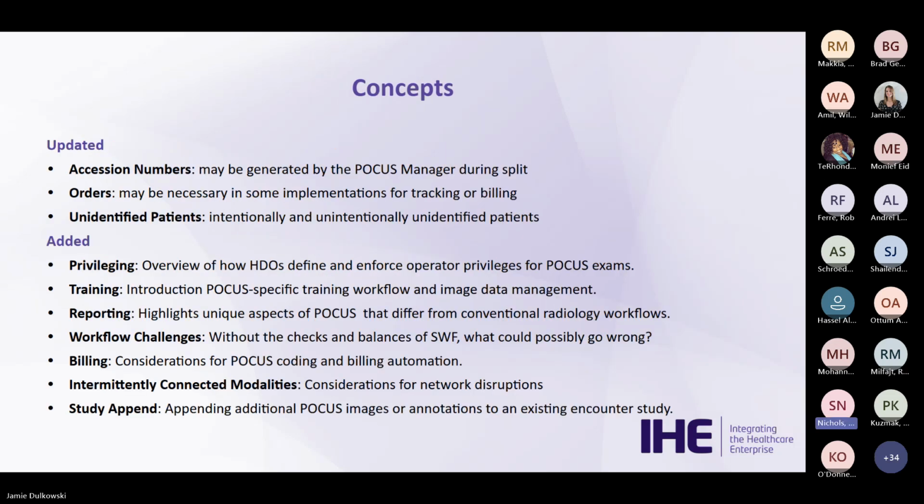So in an IHE profile, the concept section of volume 1 provides underlying principles, assumptions, and key elements that guided the implementation of the integration profile. So this is kind of like our encyclopedia of information that we used as guiding principles when it came to developing this profile.